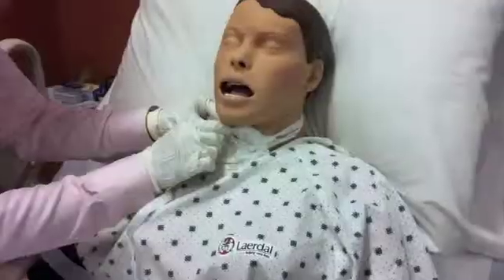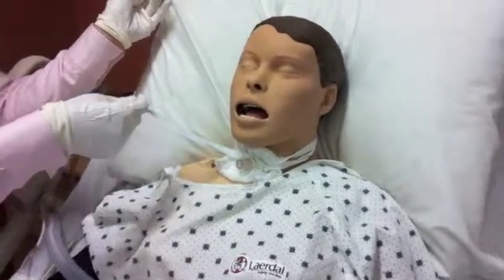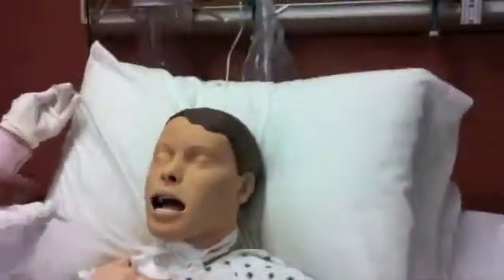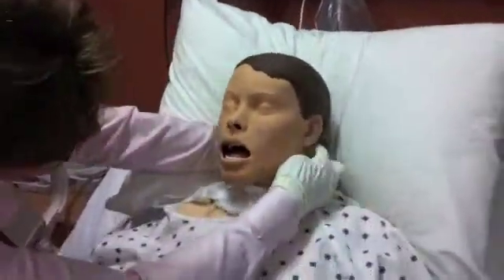Now you're going to tie the neck plate onto the patient with a clean tape. Do your ties, get it situated, and then remove the old tie.